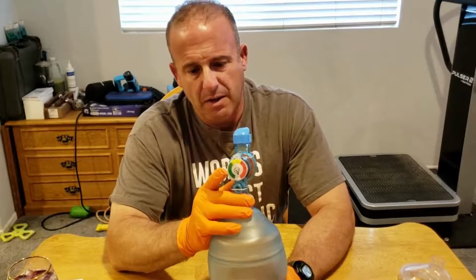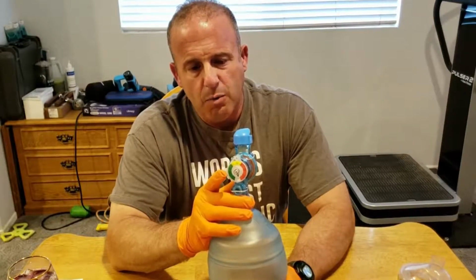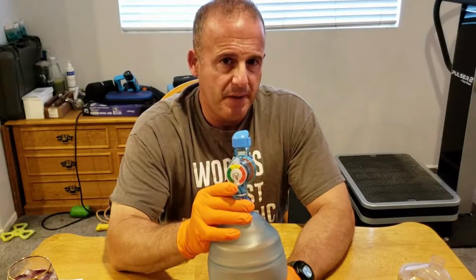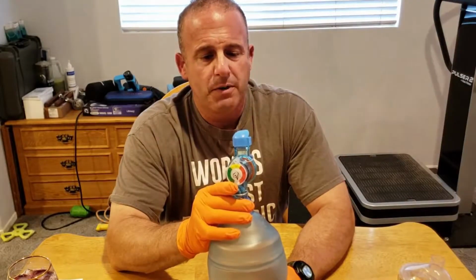One of the big reasons for placing this in the bag valve mask system, which we here in Riverside County have universally adopted, was to avoid overinflating the lungs in patients who are bagging. The overinflation of a patient's lungs, especially when they're in cardiac arrest or they're hemodynamically compromised, almost inevitably will cause a decrease in venous return. And that will then cause reduced cardiac output, which completely works against us. Without cardiac output, we cannot oxygenate and perfuse the body.